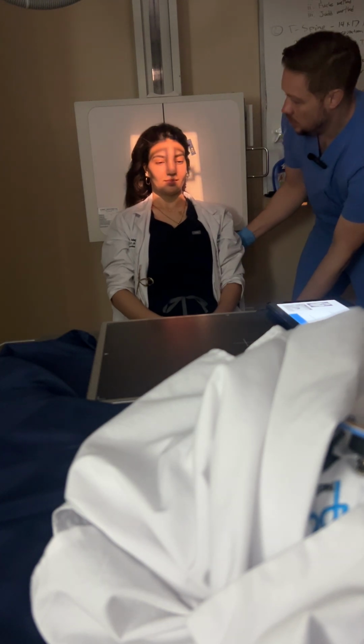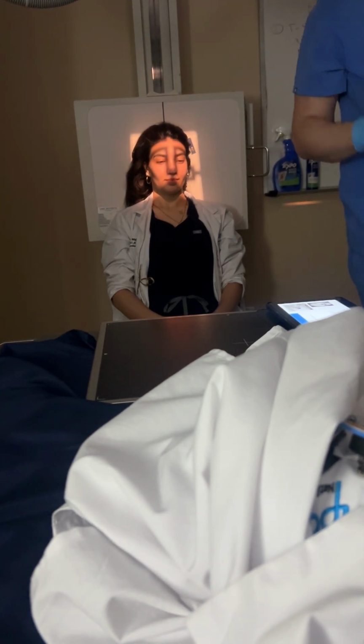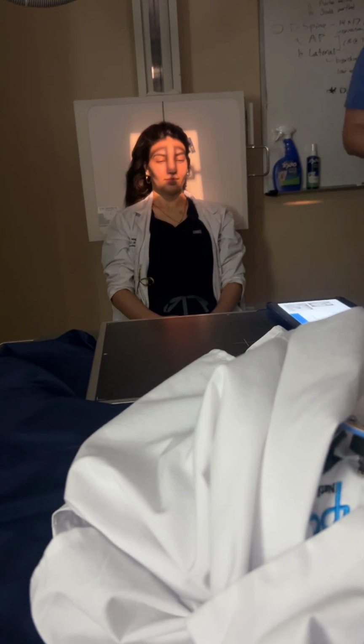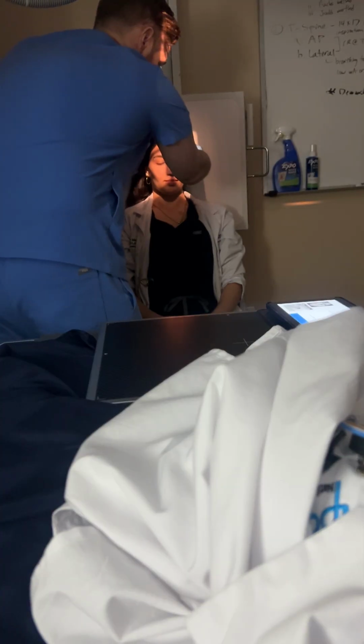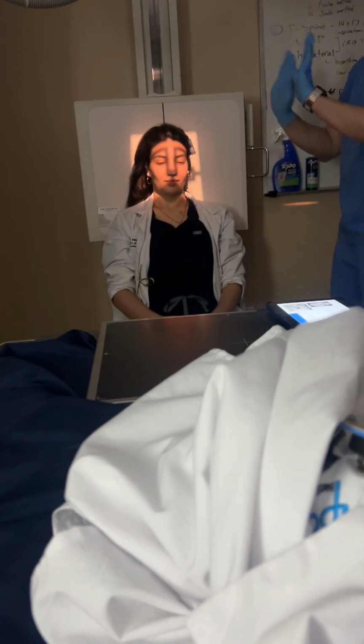When you position for the skull, very important that you check your rotation and your tilt. So you're going to come to the front of your patient, make sure their head is not rotated, and make sure that their head is not tilted either way. Okay, so that is the AP axial Towne method.